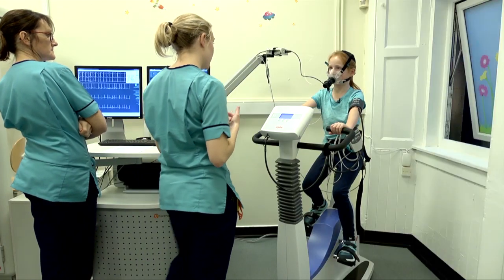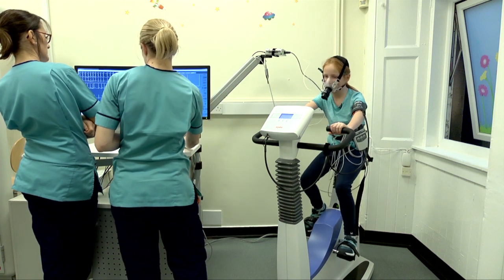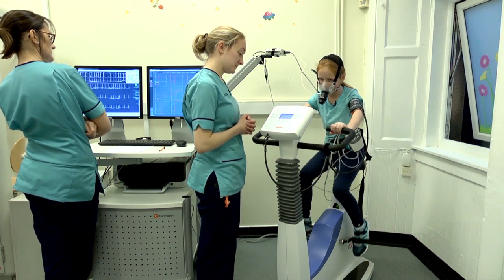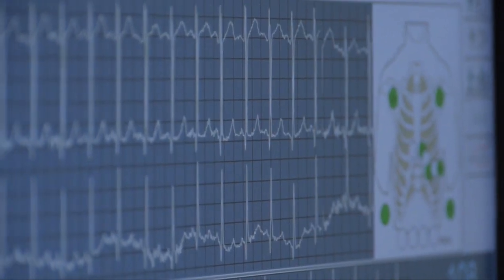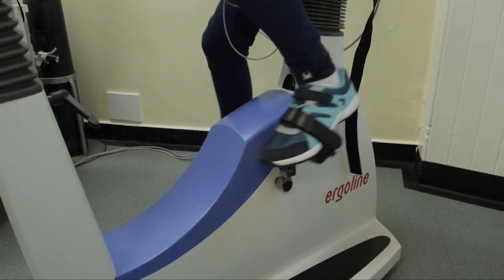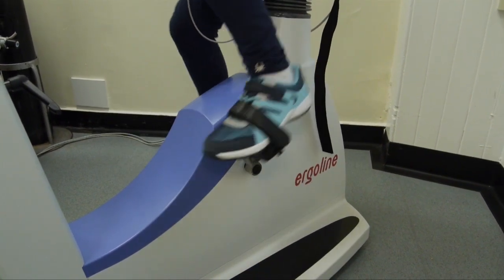So I'm going to get you to start pedalling — just gradually build your way up to 65. That's it. Well done. So that's the pace we want all the way through — just nice and steady like that, not too fast, not too slow. And we'll do that for like five minutes.